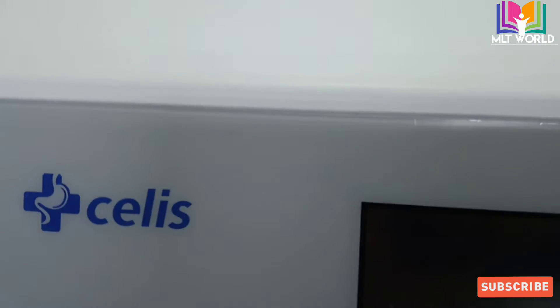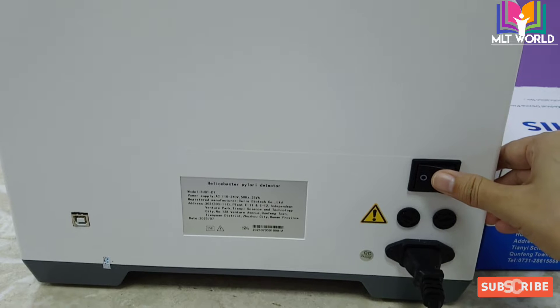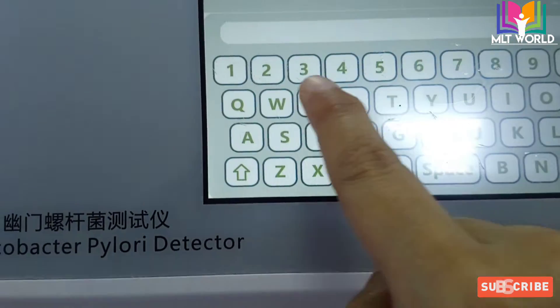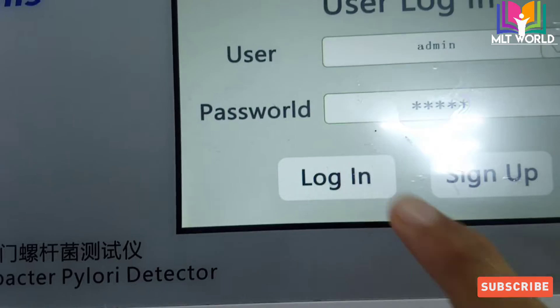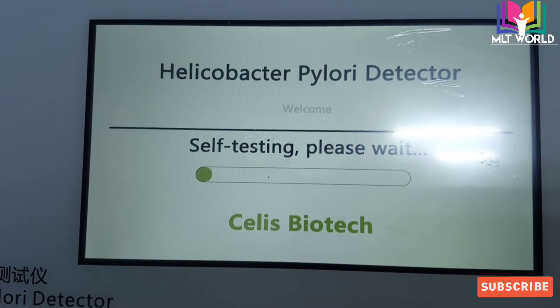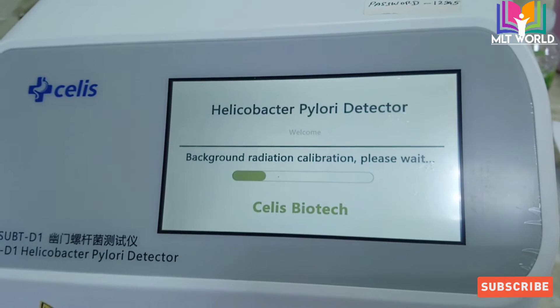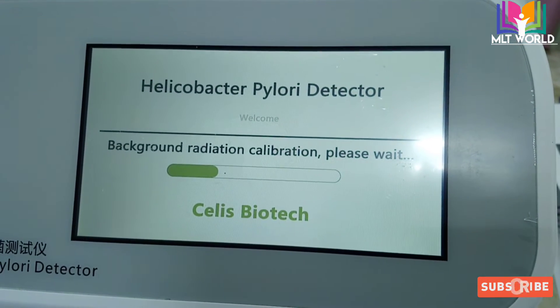Welcome back to MLT World. Today I will show you the machine for the H. pylori detector, done by urea breath test. This is the back side of the machine. We call it the helicobacter detector machine, or urea breath test machine. When we launch the machine we have to enter the username and ID. This machine is from China. When the light turns on it means the machine is on. When first switched on, it will go to self-testing, which will take some time.